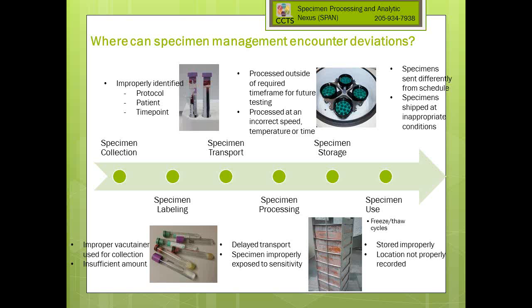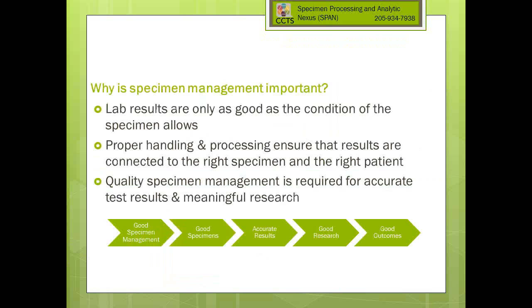You need to make sure that the right Vacutainer is used, as we've talked about. So remember some of the general rules. If it's DNA, don't use a green top. If it's RNA, you need to work fast. Serum tubes are these orange or tiger top ones. These are the ones with the gel barriers in them. That will give you serum that will clot. Purple and green give plasma, which doesn't clot. And then you need to think about how you're going to store them, what type of mechanism you're going to use to actually put these in the freezer and retrieve them.